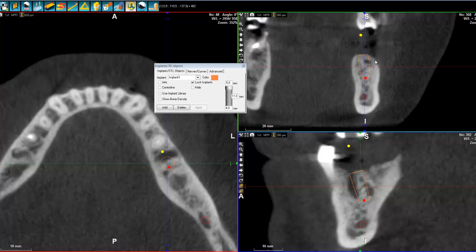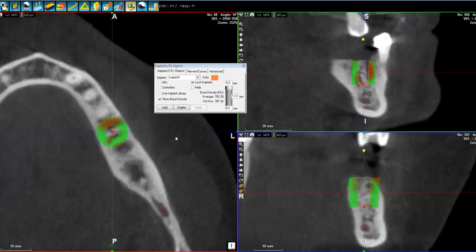As you can see, we have our implant that is tilted, and what I'm going to do is simply click on Show Bone Density. What the White Fox imaging will do is simply center the image on my implant in all three views.